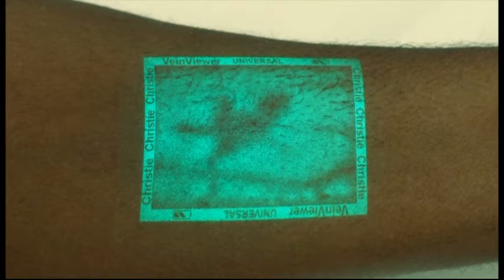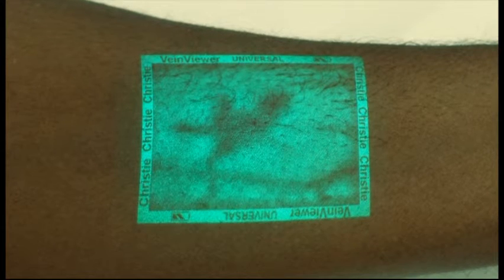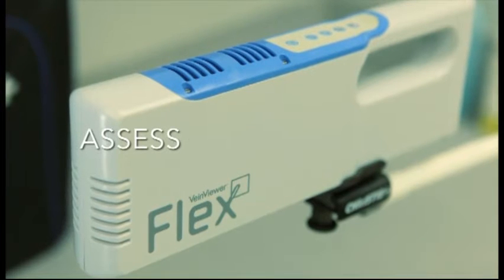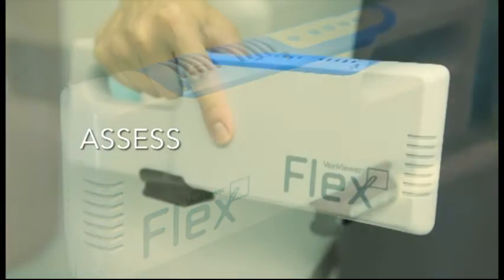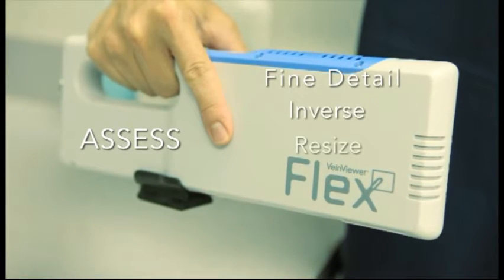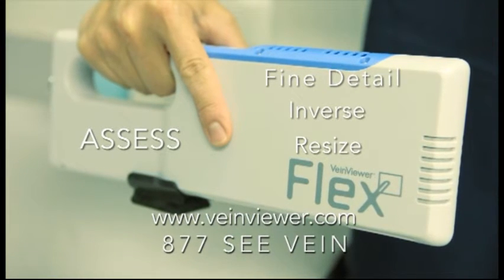VeinViewer Flex comes standard with our universal imaging mode, which is appropriate for all patients and part of the exclusive Assess Imaging Suite. The following Assess Imaging Modes are optional and require a software upgrade. To add any of these features to your Flex unit, contact Christie Technical Support through VeinViewer.com or by calling 877-SEE-VEIN.